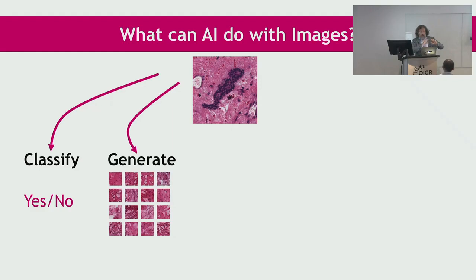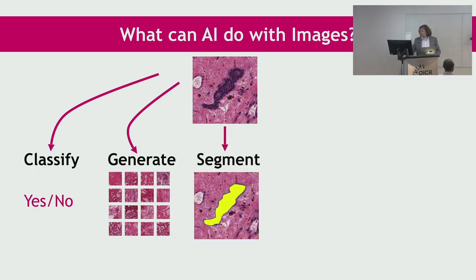They can be just a servant. They are not in charge, they just serve. And generating images is one of them. Of course, segmentation is an old thing, has been around for quite some time, with or without AI. You just look after getting a certain region, a certain tissue type, most of the time cell nuclei, segment them, count them, based on whatever diagnostic need you have.